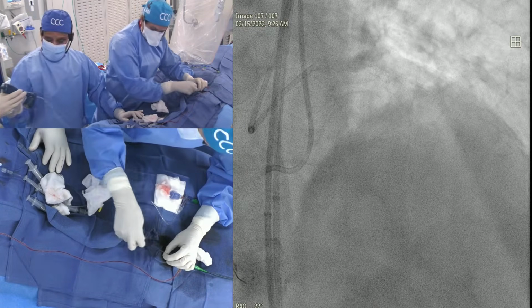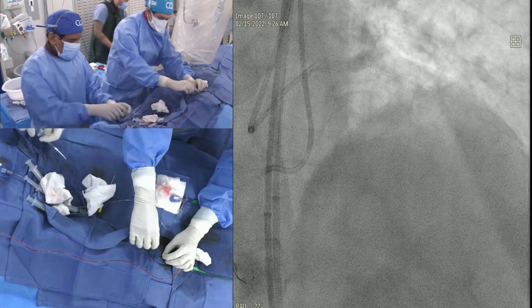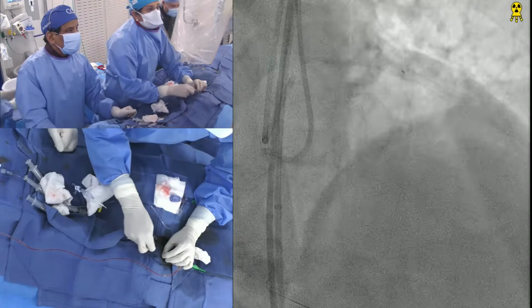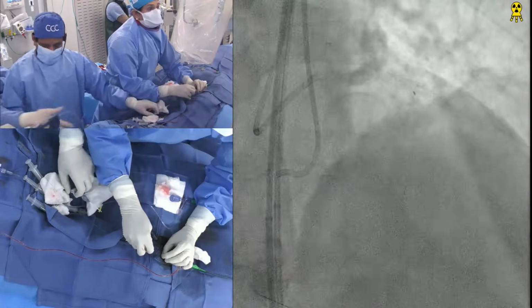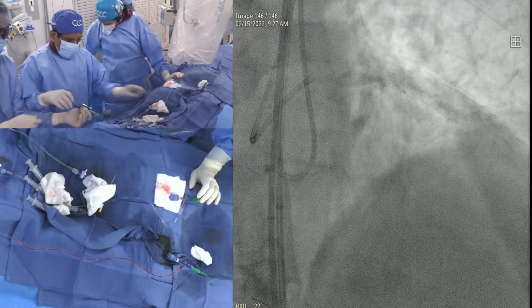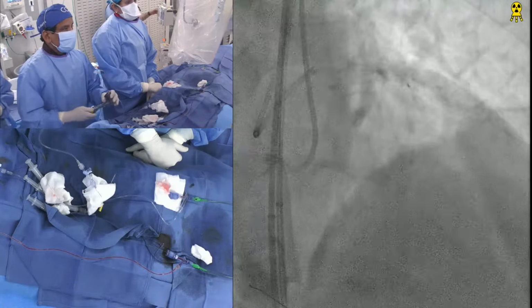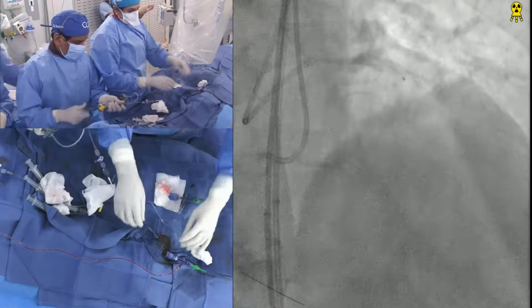So the wire is there. Remove this. Disconnect. Look at that, it made it. We need a Rota of the septal. The original case when you had stented, the LAD had used rotational. Rota was very calcified.